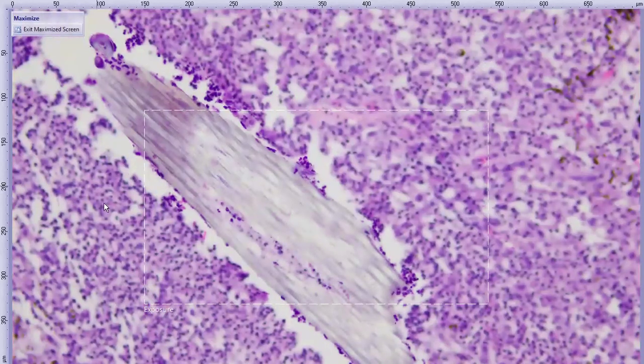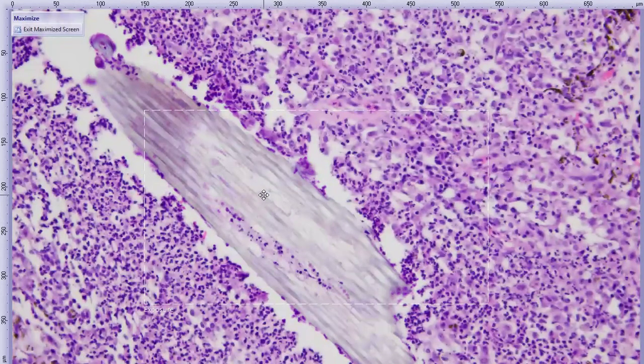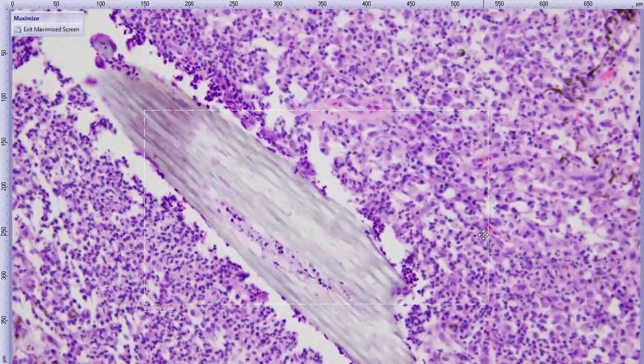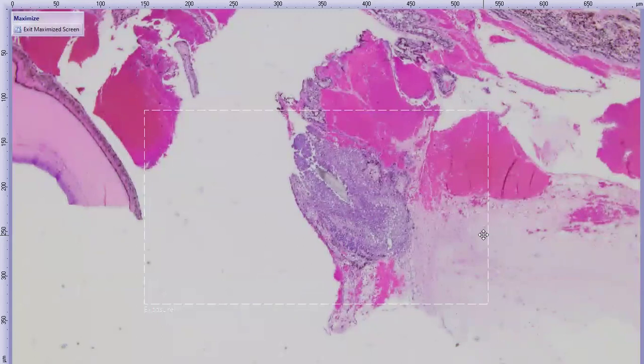So it is very antigenic. These plant objects often come with their own flora and fauna of fungus and bacteria and all that stuff. This one actually looks relatively clean, but you can see it is surrounded by neutrophils. So this is consistent with plant material. Probably this is a grass awn that migrated through tissues and sadly ended up in the eye.